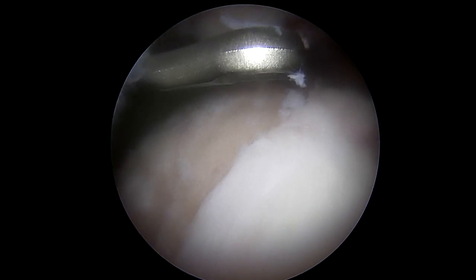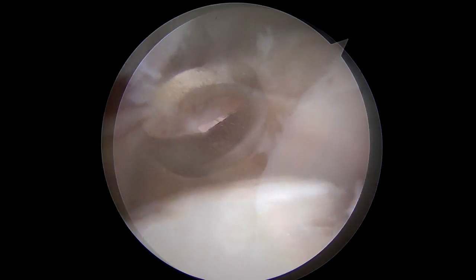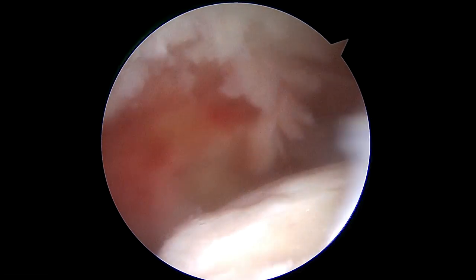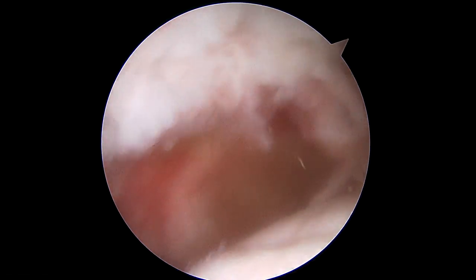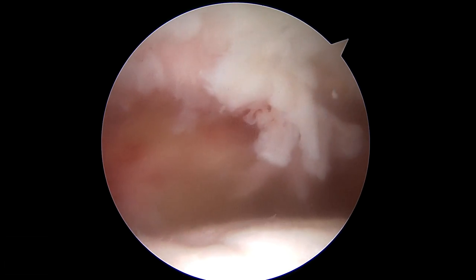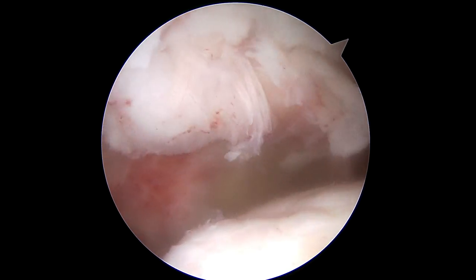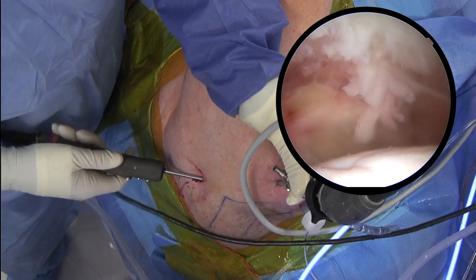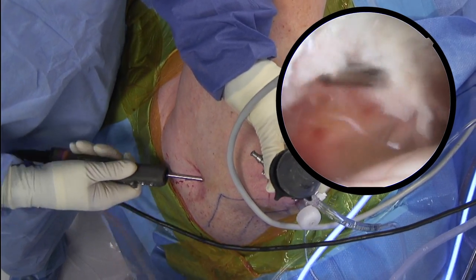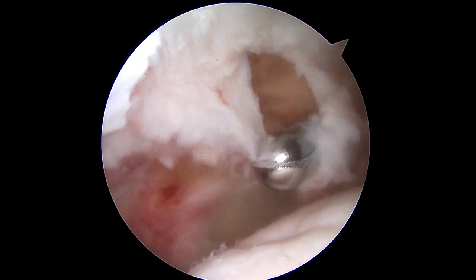I think it's really important to have a good consistent bleeding bone surface. I like to refine that margin a little bit — ring curettes are good for that. Now I want to try to dissect whatever cuff he has and preserve whatever there is. He's obviously scarred in against the acromion. What I do is bring my shaver in from a posterior portal, hit the scapular spine, sweep out laterally, and then I see my shaver start to come through these soft tissues. That's how I know I'm in the right plane.